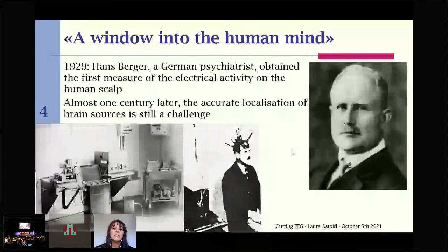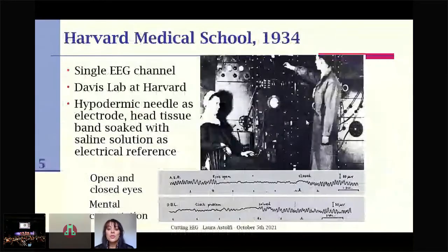In some sort of way, it was true from the beginning. On another side, we are still struggling with the accurate localization of brain sources. So it's still not entirely true. We are working toward that. And I will show you a general description of the problems, even still open problems, and some applications.